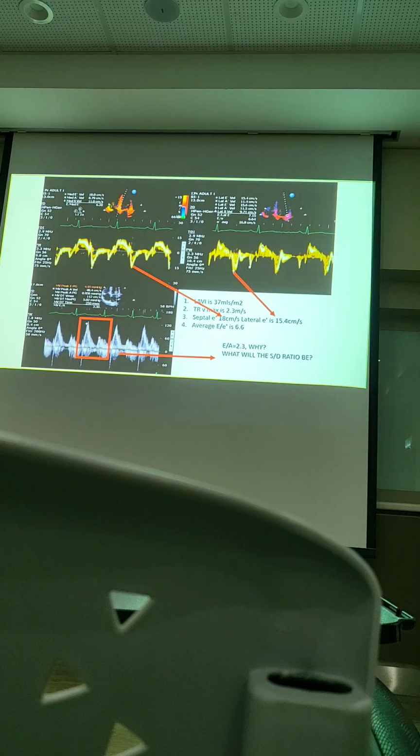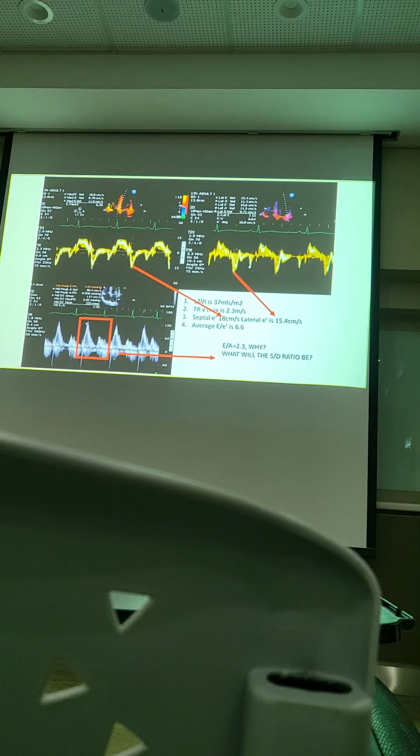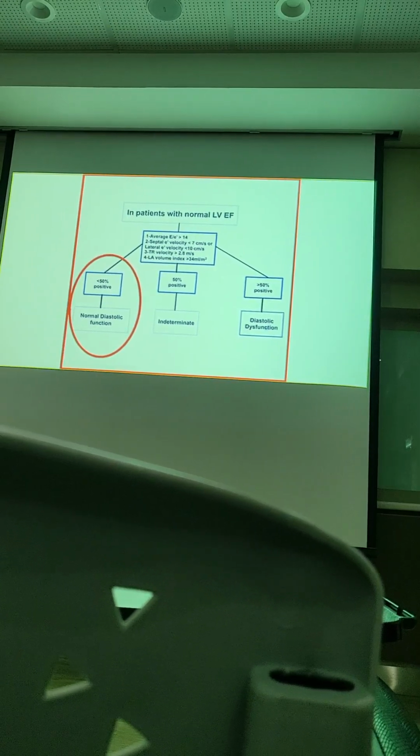So when the heart is very efficient, during the E wave, the LV sucks the blood from the LA very fast. Sebab tu dia marathon runner, sebab dia very athletic kan. So the heart is very efficient, can suck the blood from the LA to the LV, cepat. That's why the E wave is very high. And when you calculate the E over A, it will be more than 2. Tapi actually patient is very athletic, very young patient yang fit semua kan.